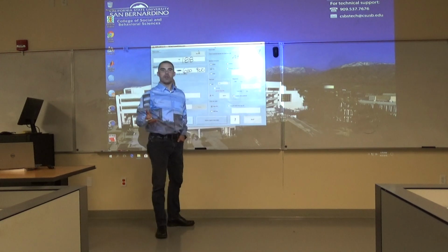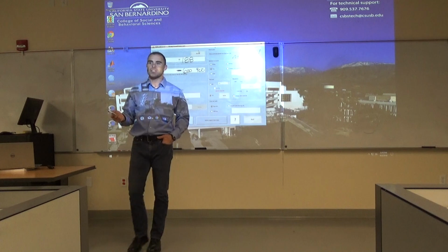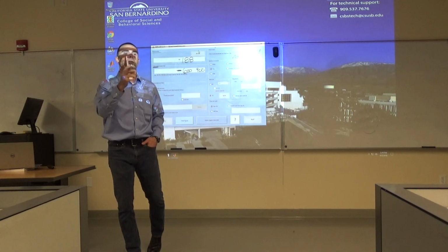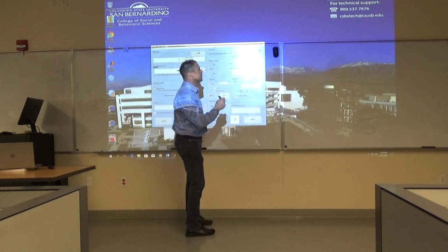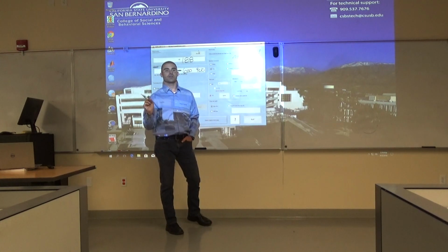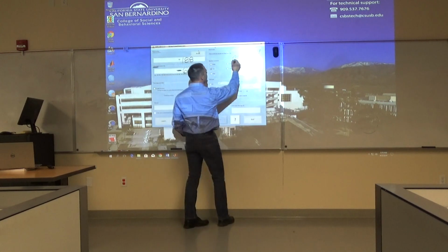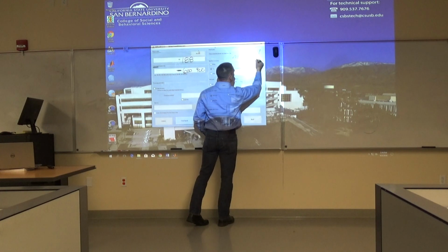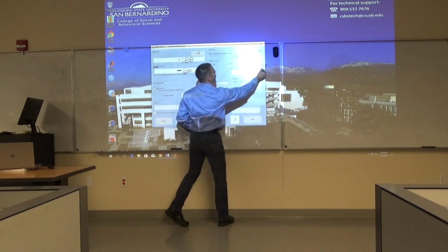Not because we're angry people, but because you guys have all taken statistics and you know that averages are nice. Mean amplitude between two fixed latencies.